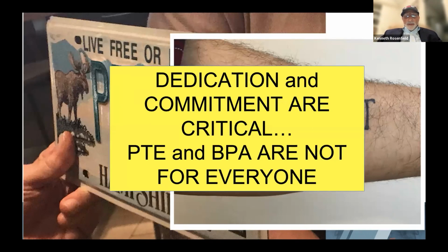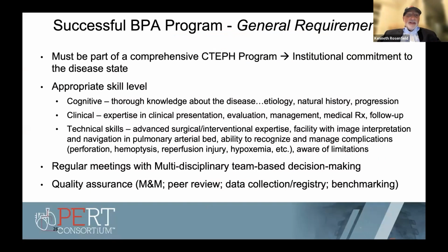Those are critical. PTE and BPA are absolutely not for everybody, nor are they for every institution. Very much different than PERT, because this is a problem that is not nearly as common. It is very specialized. It is much more challenging. And unlike in PERT, there's time to figure out what to do and what's the best therapy for each patient.